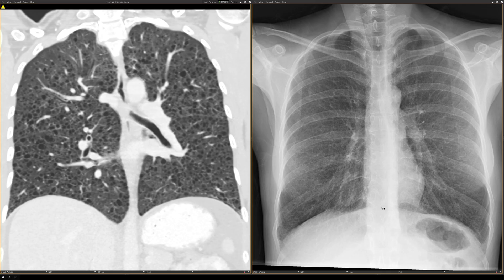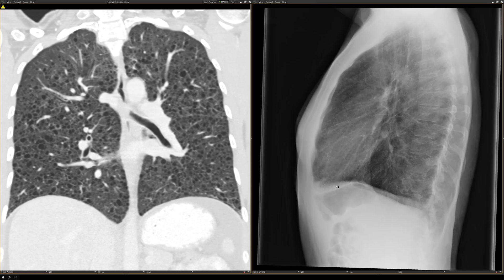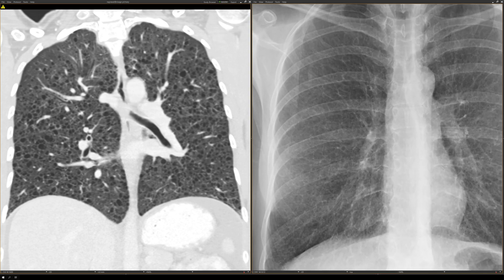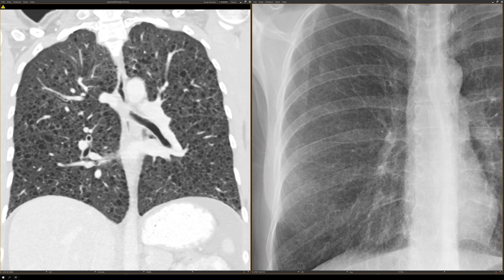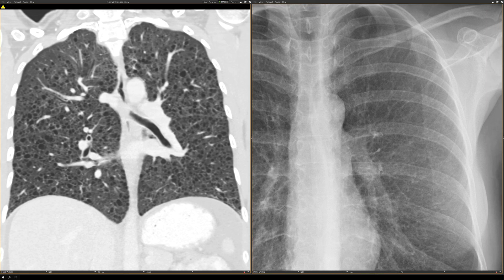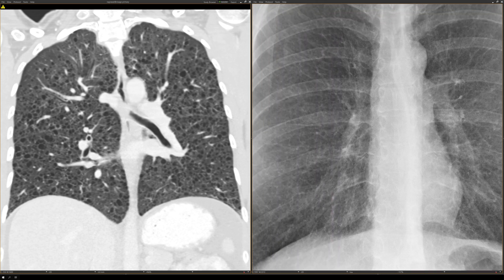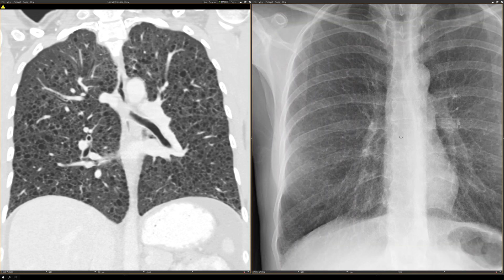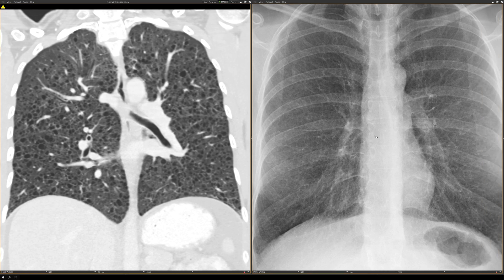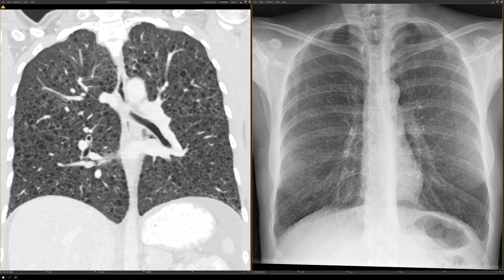Here's the last patient — I want to start with the chest x-ray. You'll notice two things: first, there's flattening of the diaphragm, which is a sign of hyperinflation. Second, if we zoom in, the patient has too much reticulation in the lungs. Reticulation is often a sign of fibrosis like UIP, NSIP, or chronic HP — but here, reticulation plus lung hyperinflation should make you think of cystic lung disease. This patient was already advanced and had a known diagnosis of LAM.